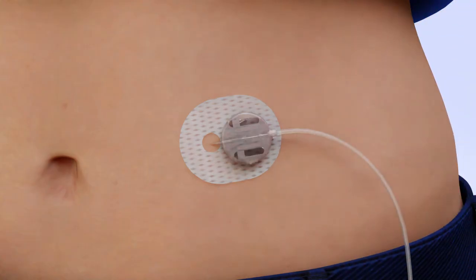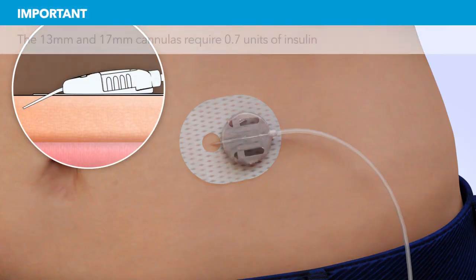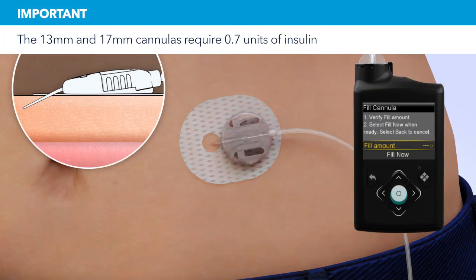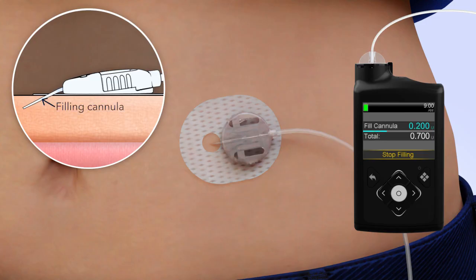Now that the introducer needle is removed, the cannula is empty and will need to be filled with insulin. On your pump, select Fill. The Fill Cannula screen will appear with either dashes or the amount you previously used. The cannula requires 0.7 units of insulin to fill. To change the fill amount, press Select and use the arrows to scroll to the amount needed, and press Select again. If the amount is correct, press Down to Fill Now. Press Select. The home screen will display the insulin as it fills the cannula.